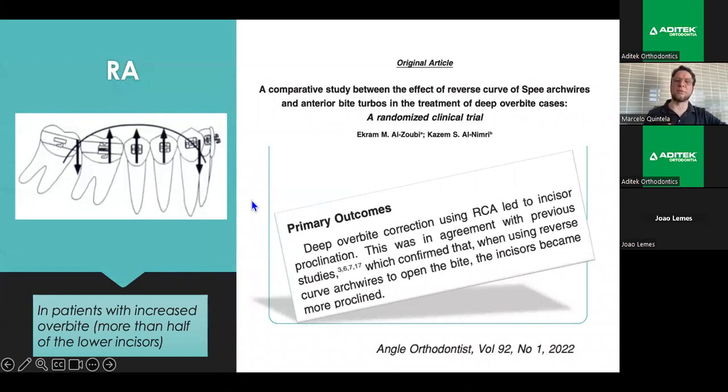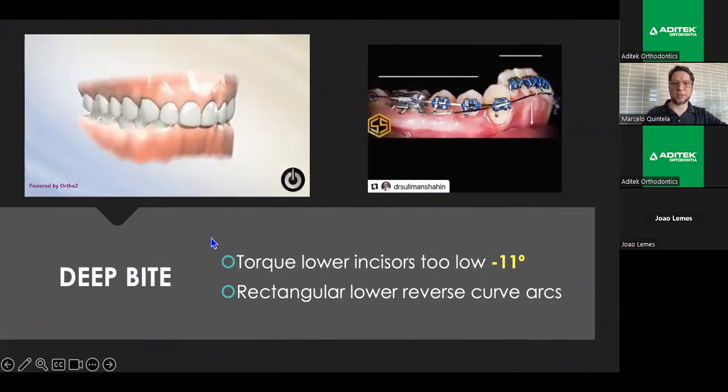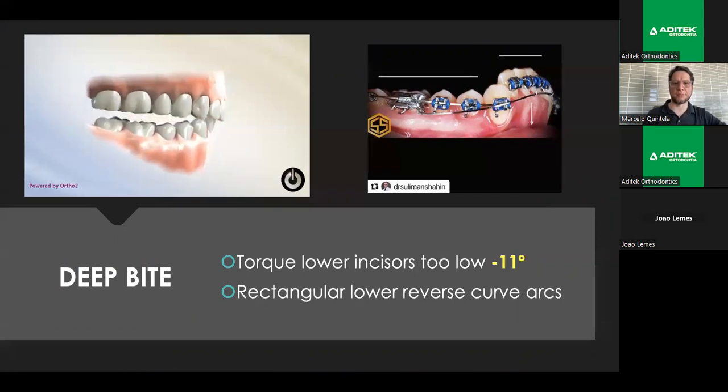So we need to put the deep bite prescription, the EasyClip by Moderna Orto, in patients with increased overbite. How do you identify these patients? When you have an overbite of more than half of the lower incisor, you have a deep overbite. So in this video, you can see what happened when you use a reverse arch.